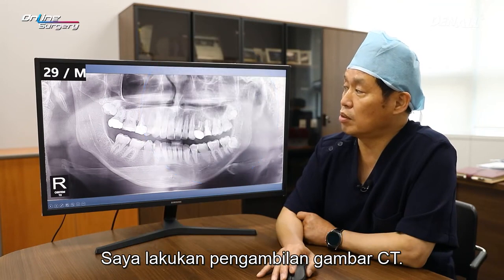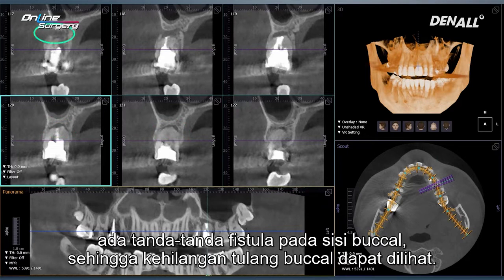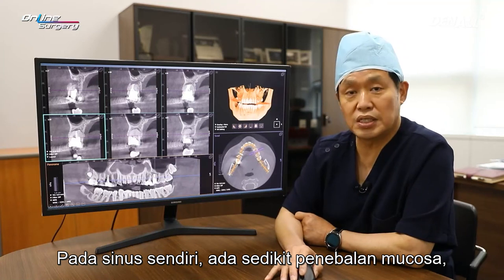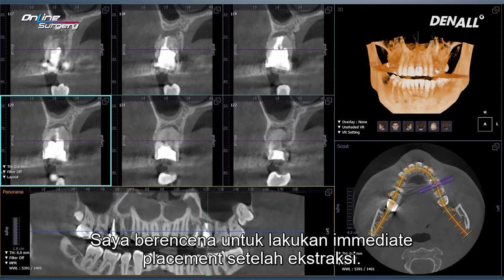I took CT. As mentioned, on the apical side of number 25, there's lesion, and on CT, there are signs of fistula on the buccal side, so buccal bone loss can be observed. The sinus itself, there's a little bit of mucosal thickening, but there's no major issue. I plan for immediate placement after extraction.